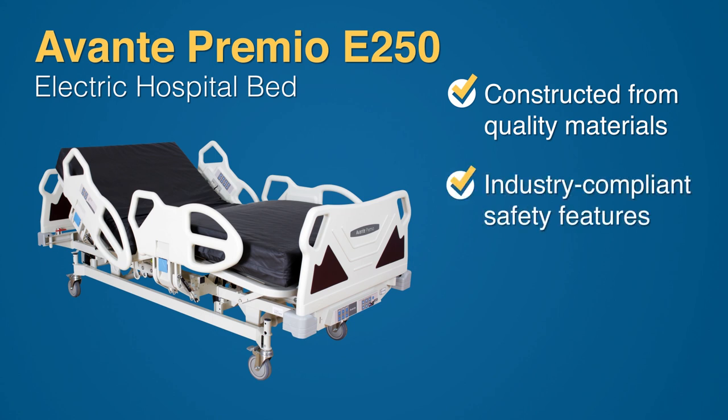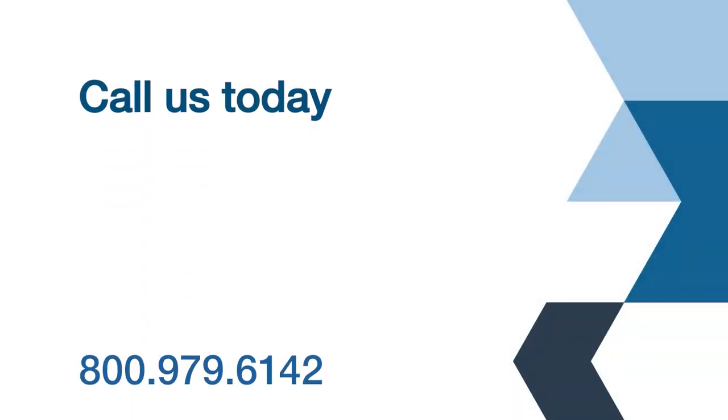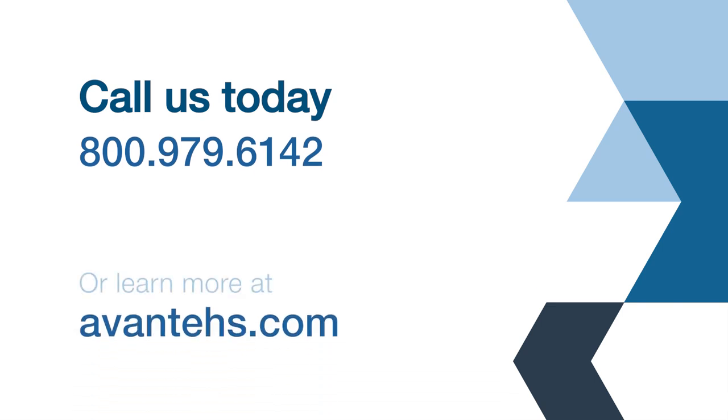Its many motorized functions increase patient comfort and safety. These qualities make the Premio E250 an ideal bed for any hospital, surgery center, or teaching facility. For more information about the Premio E250 electric hospital bed, contact Avanti Health Solutions today.